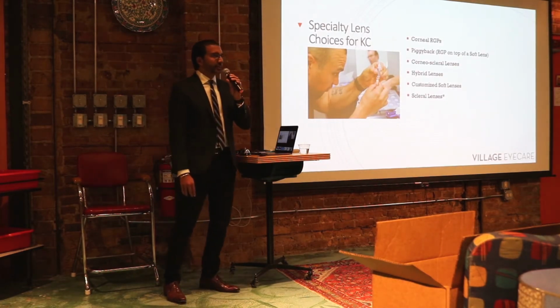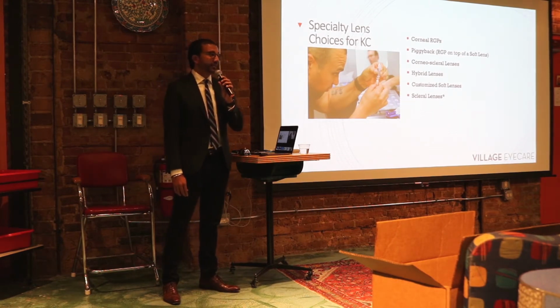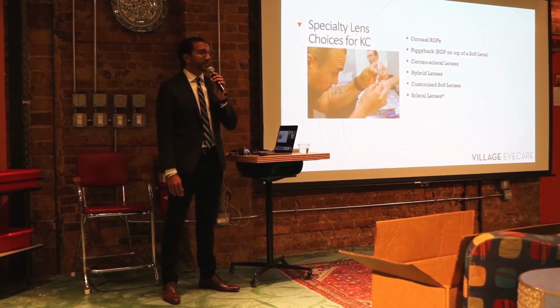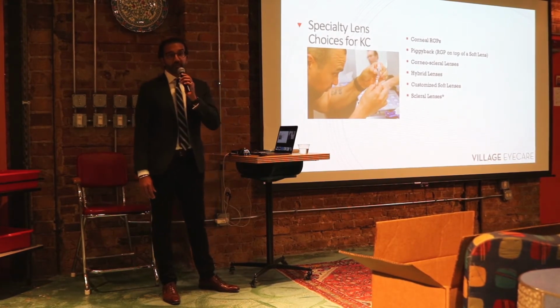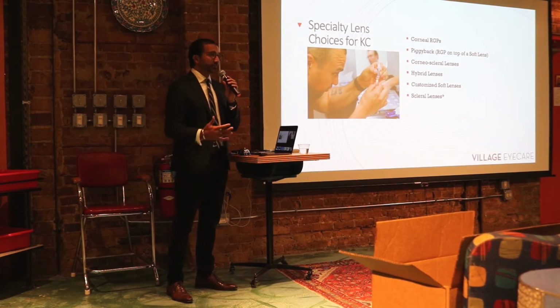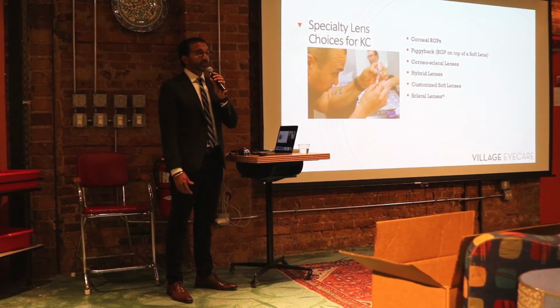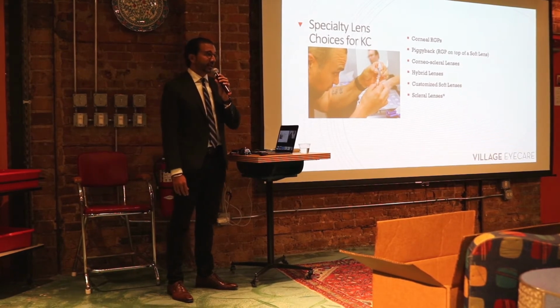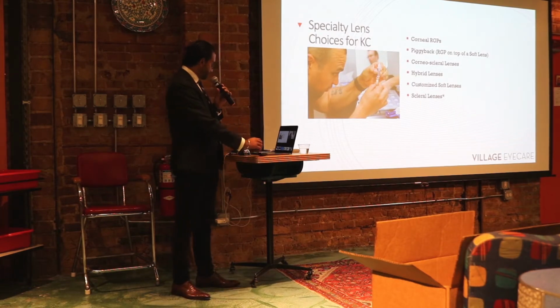My experience with specialty lenses really took off my first year with Village Eyecare. When we acquired the practice, there was a large number of keratoconus patients. At that time, those patients were effectively wearing either corneal RGPs, piggyback lenses, or corneal scleral lenses. And as we all know, in the last 10 years, the contact lens industry has made major advancements in the types of modalities that are now available, and that's led to a lot more successful fits, which really makes a positive impact on the quality of these patients' lives.